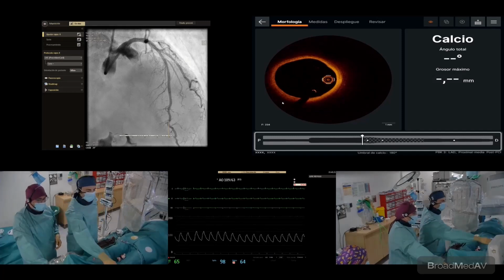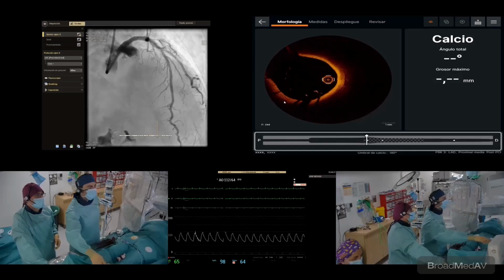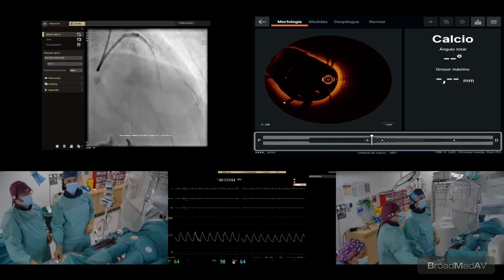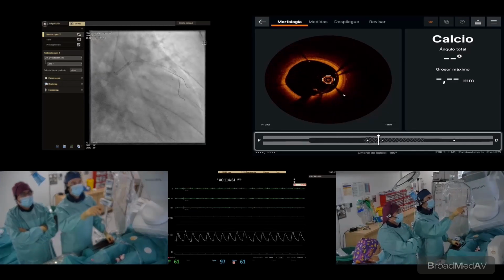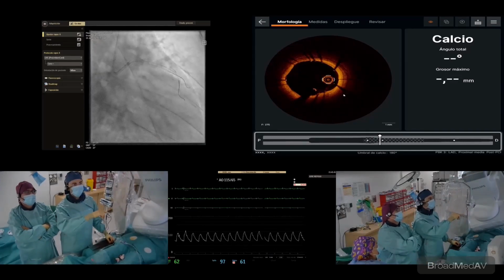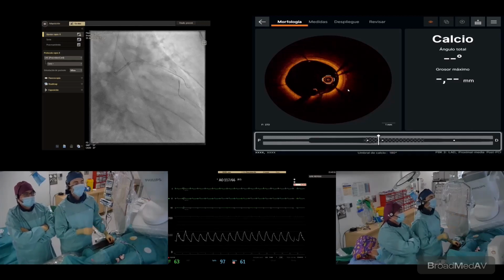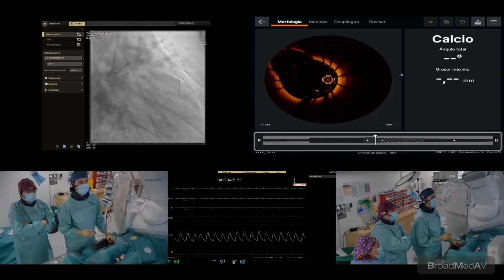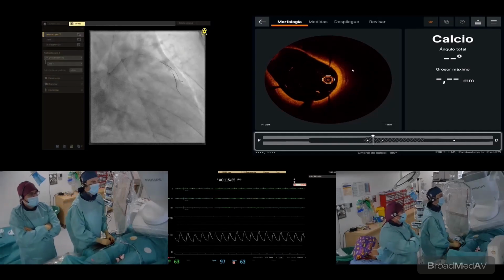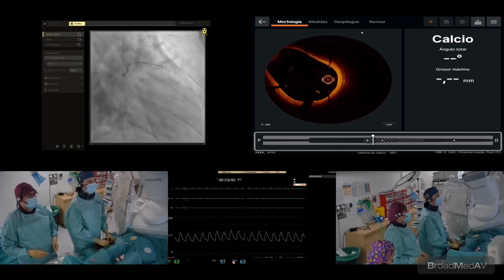It's not important. I'm going to show you the last angio here. Probably we can do the last angio in the caudal and finish. Okay. Yes, look, this is the LAD ostium that before this post-dilatation had some malapposed struts, and now is quite better. But in the origin of the circ, it's not possible because this is the image we have seen before. No, it's a very good result in our opinion.